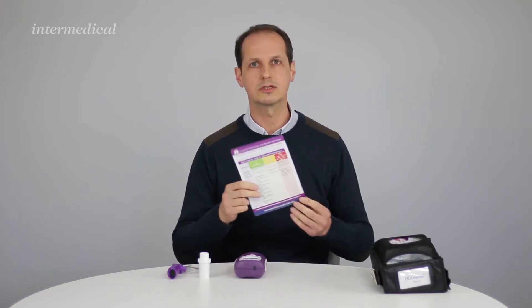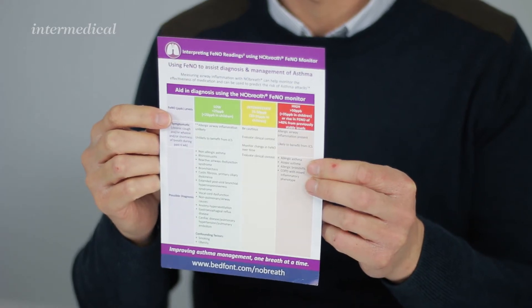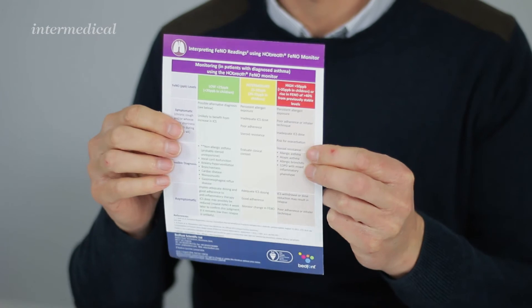The monitor comes in this carry case. In here you'll get the monitor, a mouthpiece, and a flow indicator to be put into the device. It also comes with a chart for interpreting the NO in the breath — on one side you've got adults and on the other side you've got children.